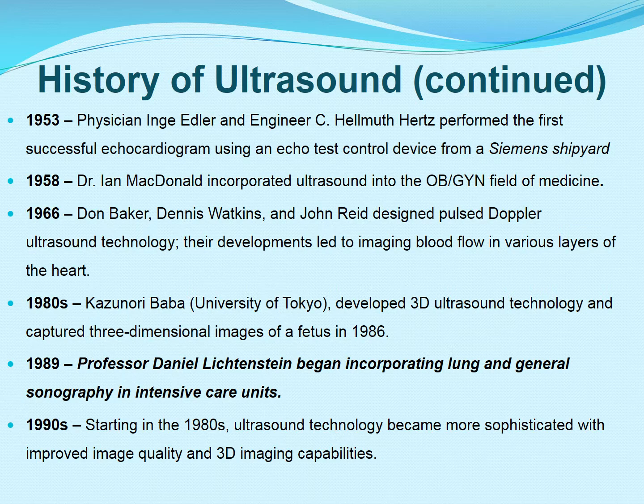What he noticed was that throughout his ultrasound field, he saw something known as B lines and A lines. Daniel Lichtenstein then analyzed that if a patient has these certain types of lines, they have increased fluid and opacity in their lung field. This signified that this patient had pneumonia.